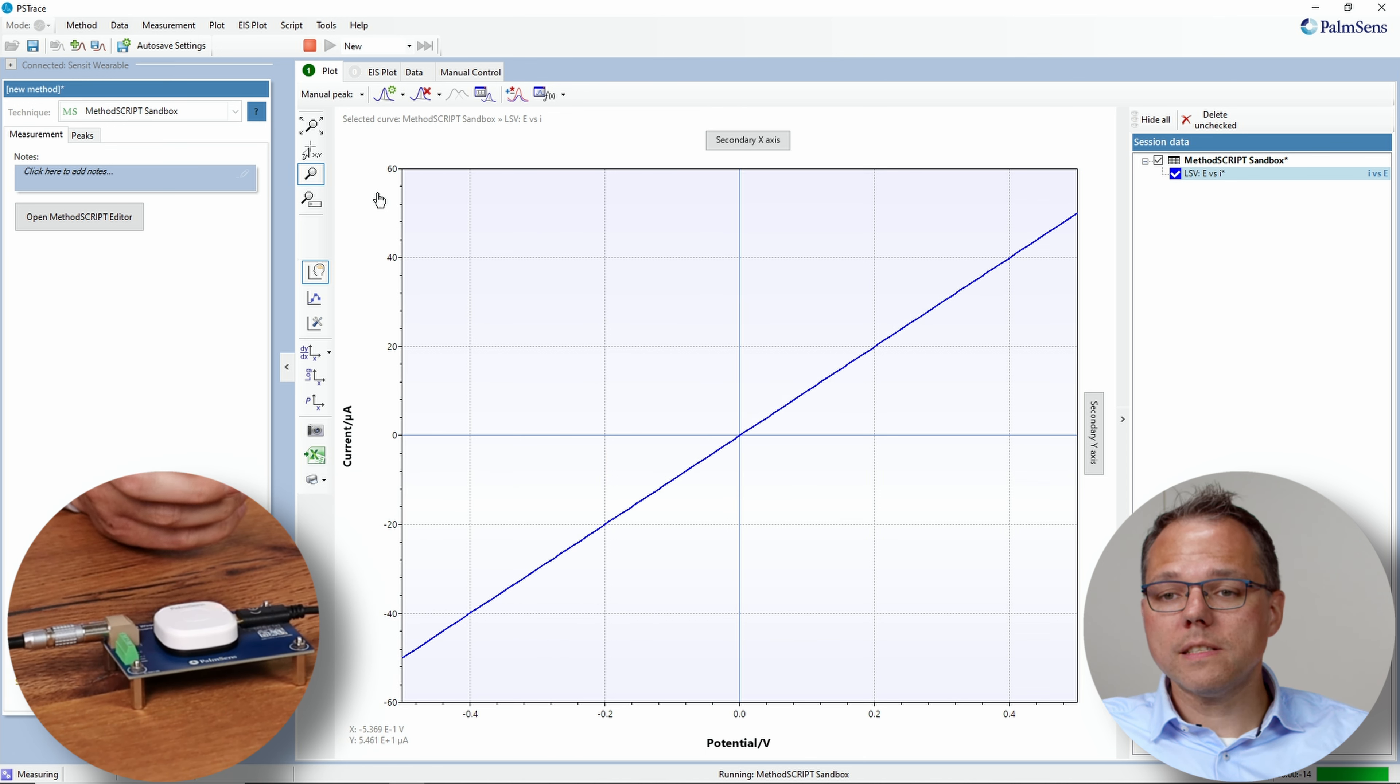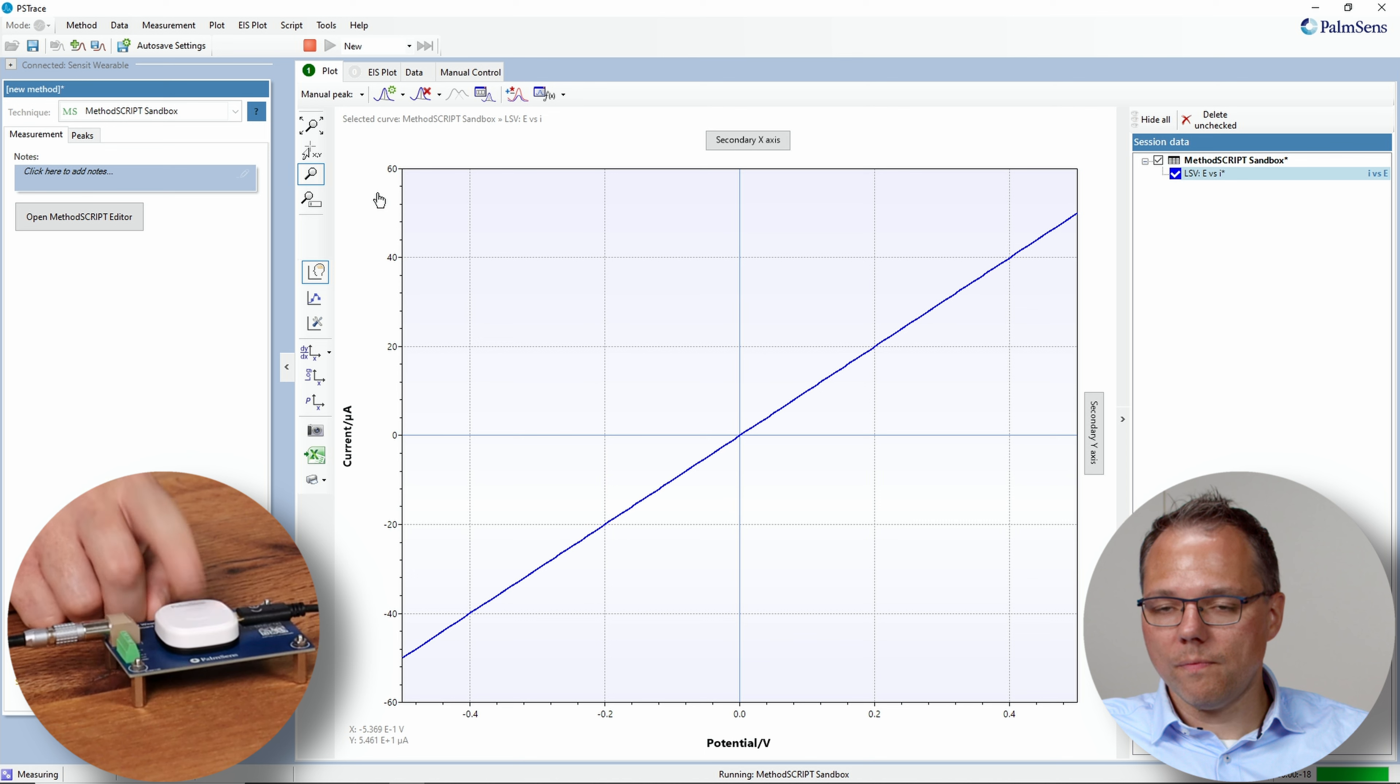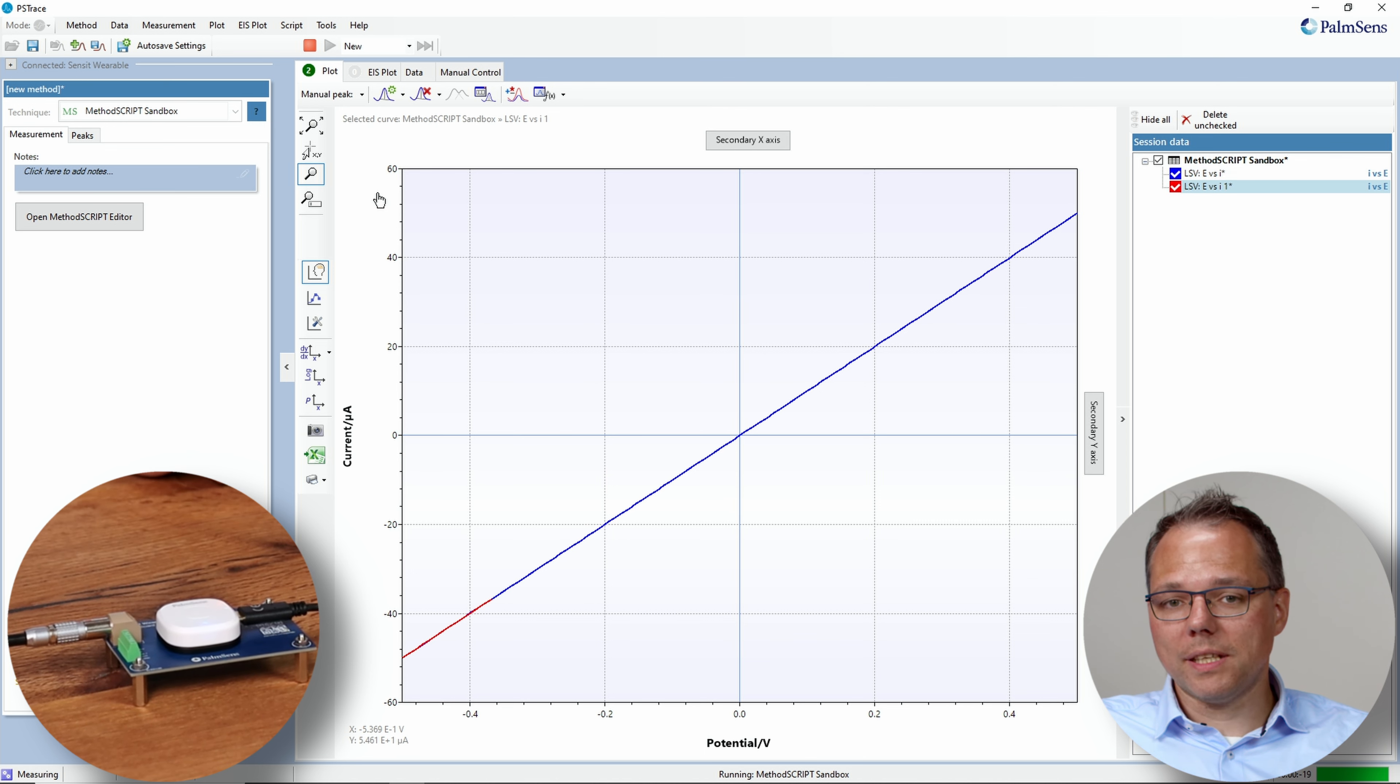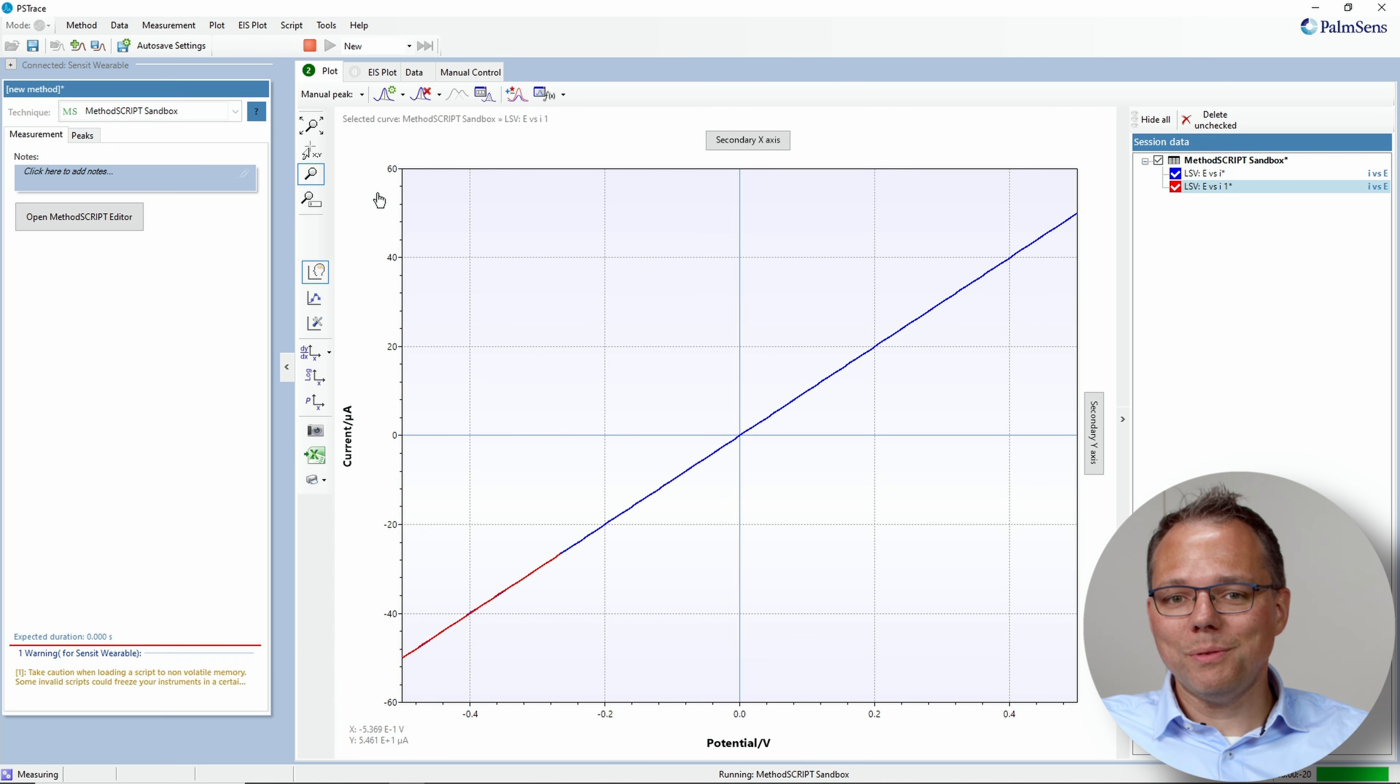And just like before, when I tap it again, it will again perform this measurement. These are different ways of performing measurements with a sensor wearable without even being connected to the software.